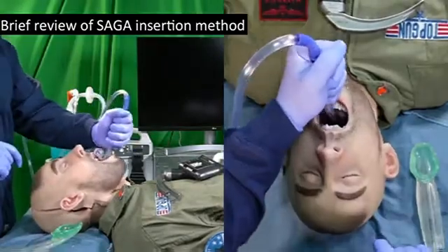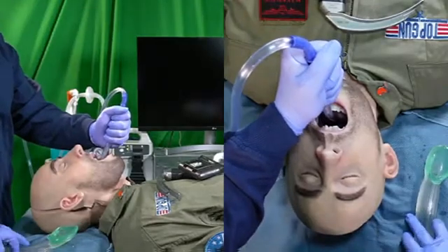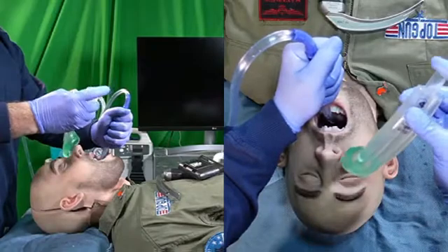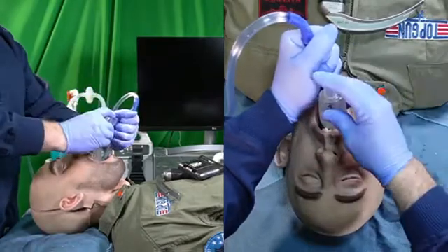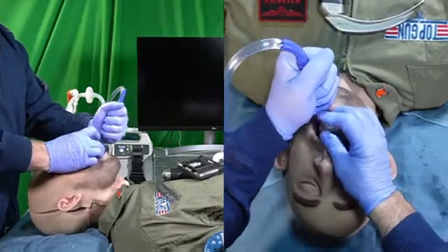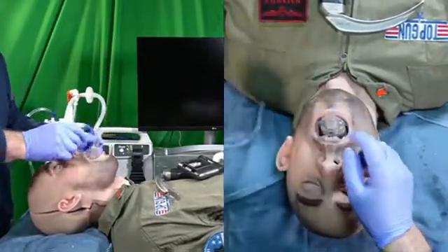You're going to compress the tongue into the floor of the mouth, lift the base of tongue off the posterior pharyngeal wall, and you're going to place the supraglottic airway by placing your index finger on the 15mm connector, which puts the vector of force along the long axis of the airway so that it can scoop around the posterior pharyngeal wall and into the hypopharynx.